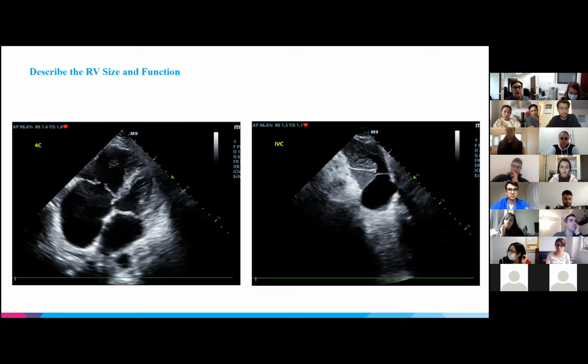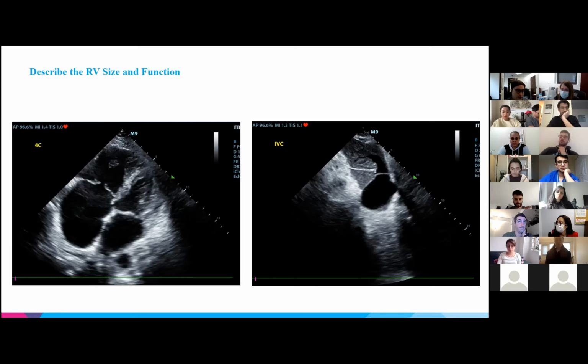And so the fact that there wasn't septal bowing sort of signified to me that there was more of a chronic process going on. I didn't actually calculate the free wall, but if we were to try and calculate the free wall in another view, you could assess as well if there was hypertrophy, then that would be more indicative of a chronic picture. But yeah, so if you see a very enlarged RV and the LV looks like it's a nice circular shape, then there probably has been some chronic response or compensation for the finding.